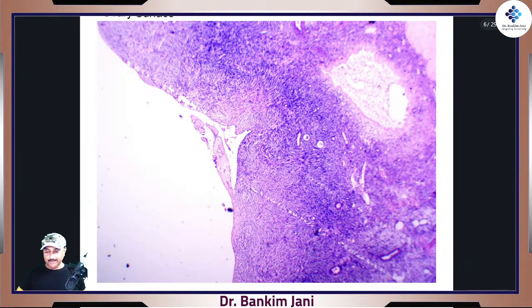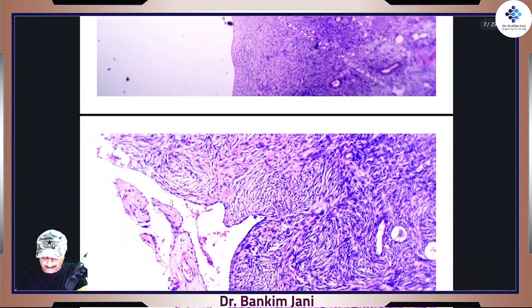This is ovary. This is ovary. The surface of the ovary. Right? So a section is taken. Now in ovary there are ovarian follicles, right? And there are numerous ovarian follicles. So they will gradually mature. So this is just like one surface. Let's zoom it further, right? And then we'll come back to this. We can see these ovarian follicles.